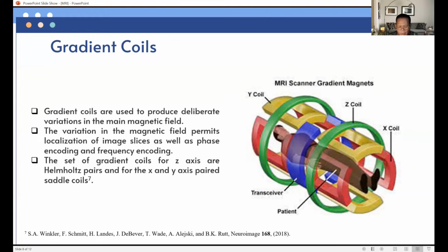A Helmholtz arrangement consists of a pair of identical coils placed symmetrically on a common axis. A uniform magnetic field can be produced in this setup when they are separated by a distance equal to their radius and having equal current flowing in the same direction through them.